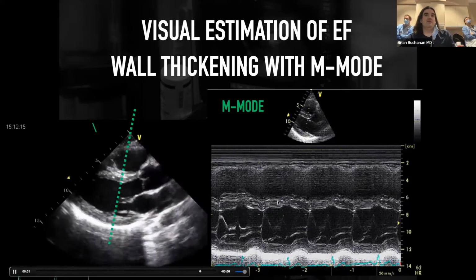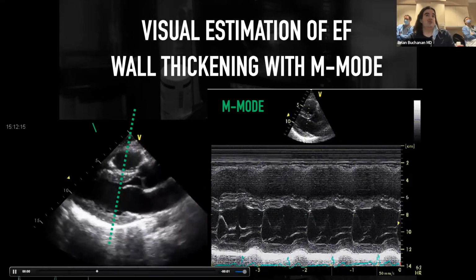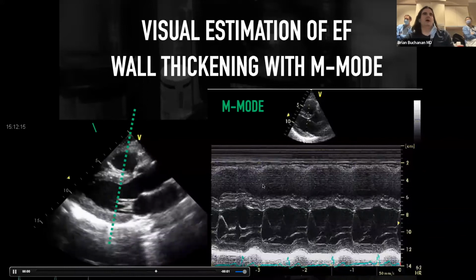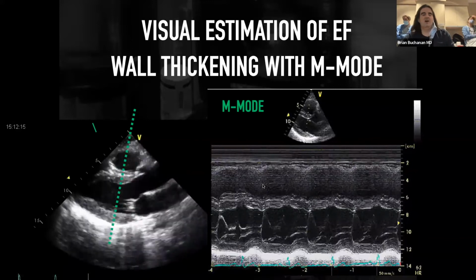So it does allow, like you can see here, you are seeing gross amounts of thickening here. So yes, you could measure it, certainly. But by and large, whether that's going to help you compared to say your visual assessment on multiple views, it's kind of unclear.